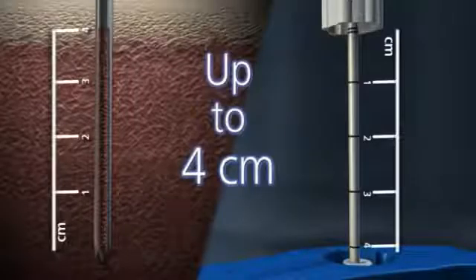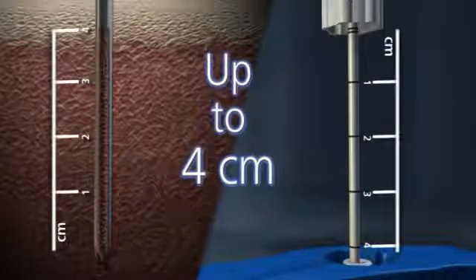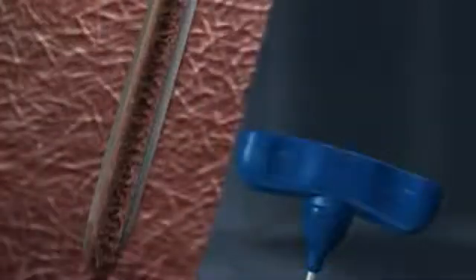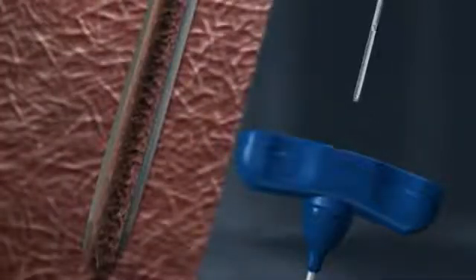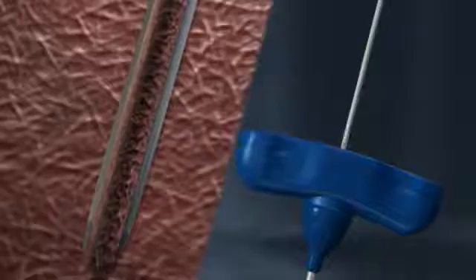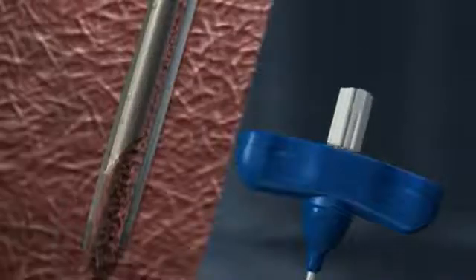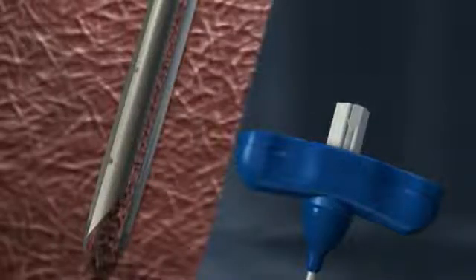The Jamshidi needle and cradle allow you to obtain sample lengths of up to 4 centimeters. Once the sample length has been identified, the marrow acquisition cradle is fully advanced into the crown cannula. The marrow acquisition cradle is rotated 360 degrees, effectively separating the bone marrow core.